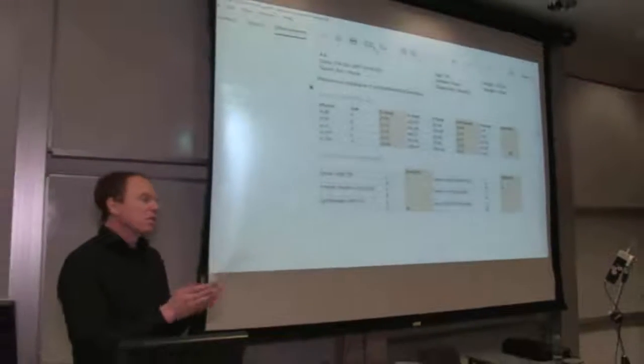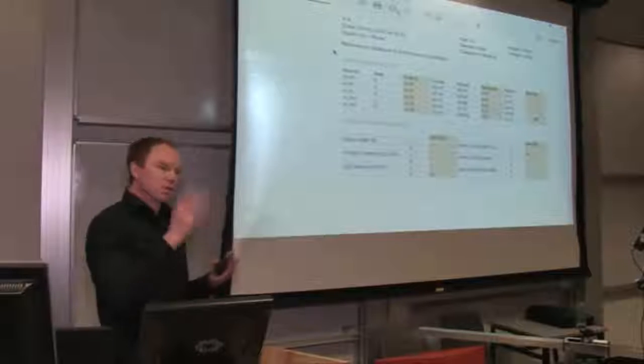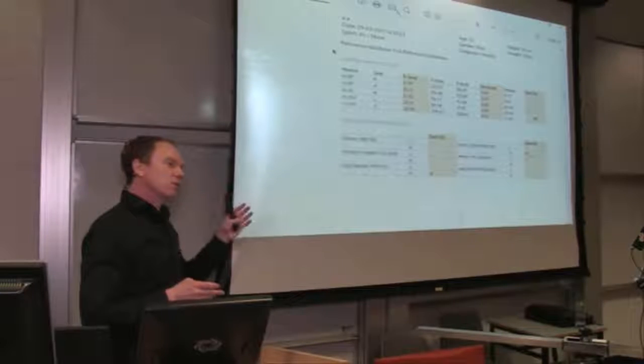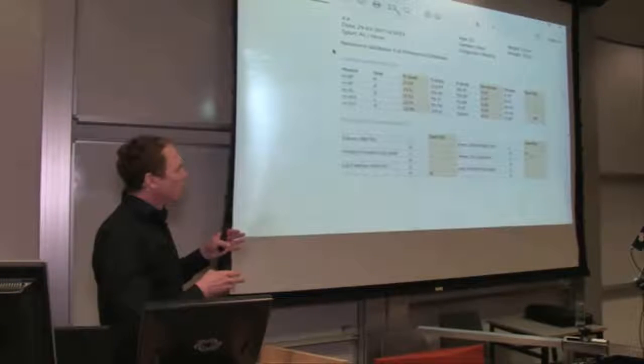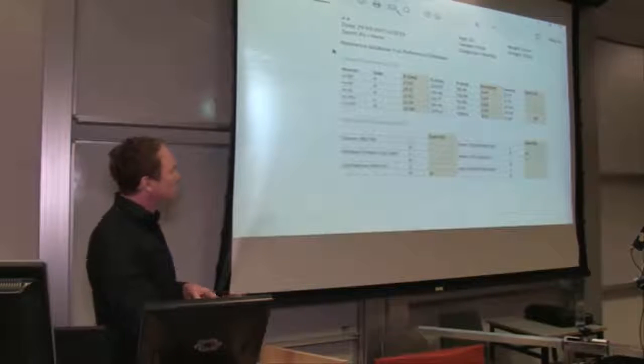Here at the end, we have the combined symmetry of all parameters. What the software does in addition, but it's not displayed, is compare each parameter and look for the differences. If the difference of one isolated parameter is bigger than 20% for the contraction times and bigger than 30% for displacement, it will give out a warning. So in this case, the number is still okay.